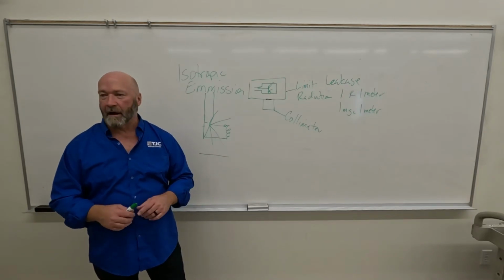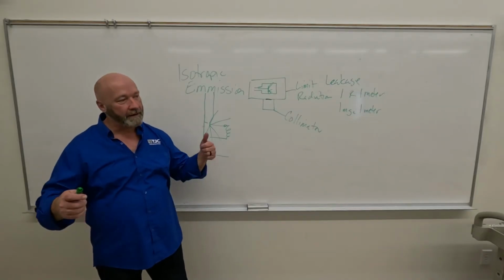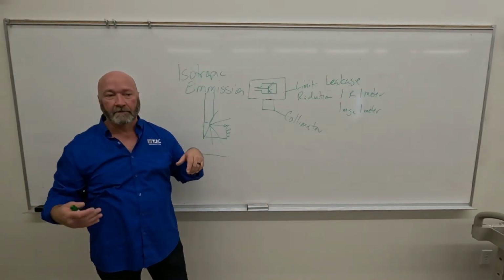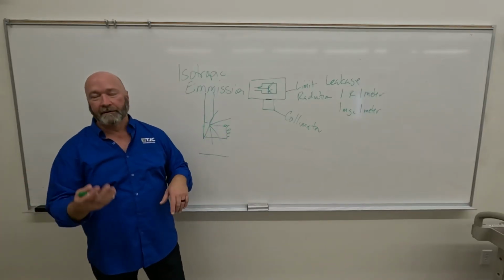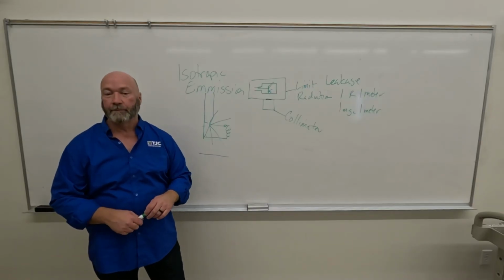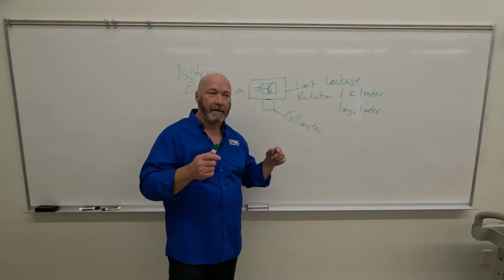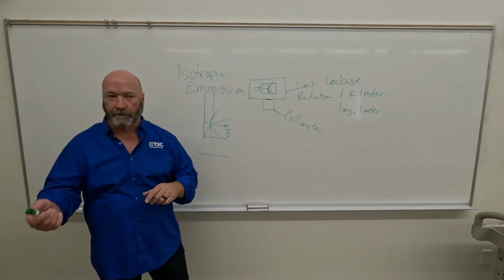With the sensitivity of our digital image receptors, I would suspect that you could probably pick up some leakage radiation if you were to point, let's say, the X-ray tube at a wall that's very far away, right? So maybe get 10 feet away and point the X-ray tube at the wall, or even at the ceiling, with an image receptor directly below the X-ray tube. You might be able to detect some leakage radiation. So that's what it protects from. It protects you from the tube, and it protects the tube again from you.